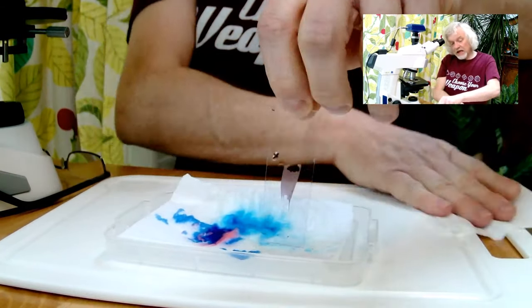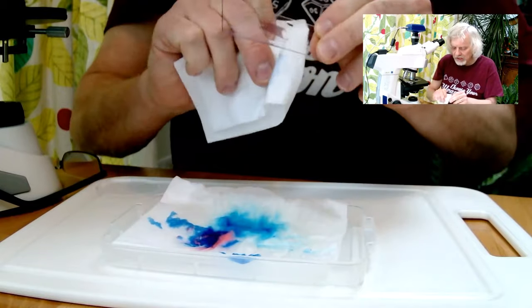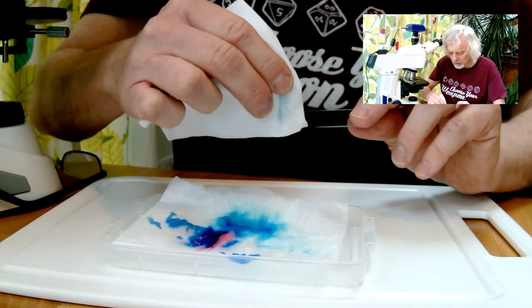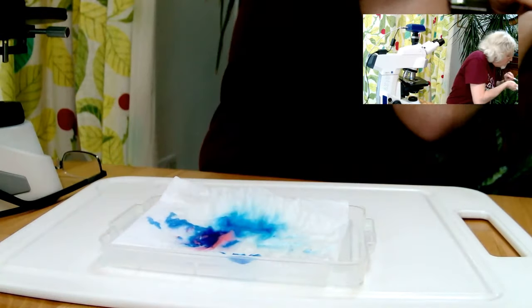now this is a technique that anybody that's worked in a hematology lab or in a hospital lab will know all about, because you do this all the time in labs. Normally you would take ages to do this, but I haven't got ages, so I'm doing it really quickly. And then I just have to blow it dry, and I'm going to do that away from the microphone.